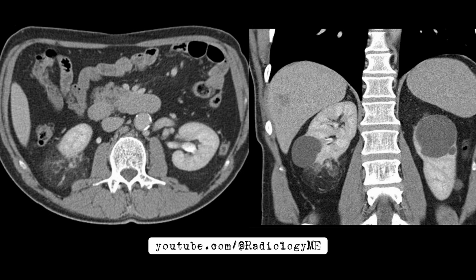The scan also didn't show any signs of adenopathy, meaning no enlarged lymph nodes were found. That's another important detail, because the presence of adenopathy could suggest a more concerning or aggressive process like malignancy. So the absence of lymph node enlargement is a good sign here.